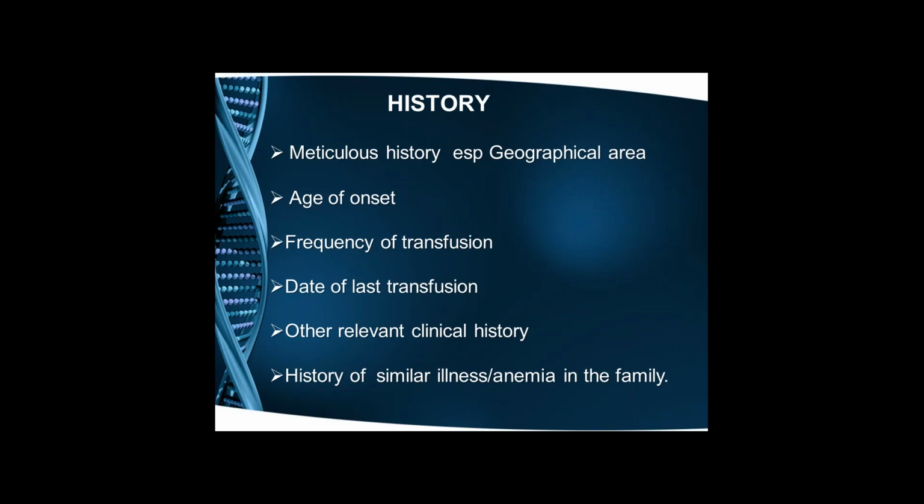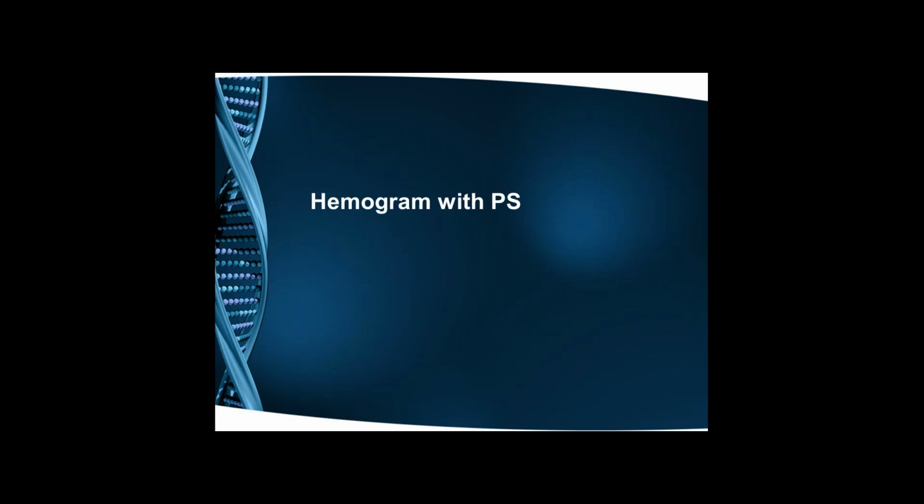Suppose you get a case with a recent transfusion history, I would suggest that you always ask for a repeat test after, say, 3 months, or we can go for an HPLC of the mother and the father to arrive at a diagnosis. Next slide, sir.